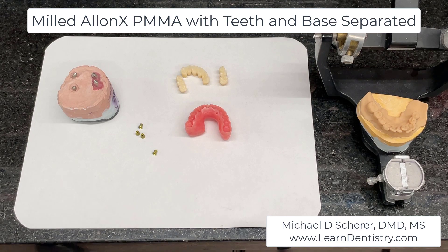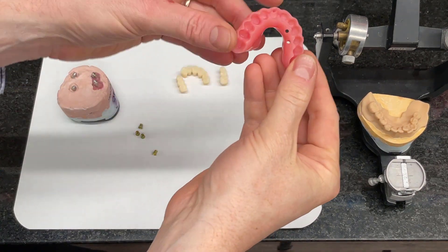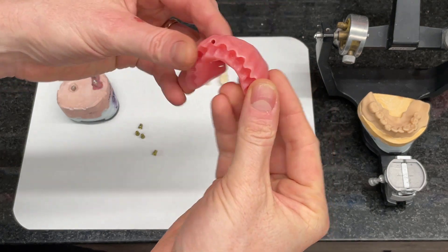Hey everybody, this is Dr. Michael Scherer. I just wanted to come to you with this pretty cool case example of milling a sectional hybrid provisional bridge on my VHF R5, that I designed in ExoCAD using techniques that I've learned from ExoCAD masters Joshua Jackson and Johnny Overnakis.